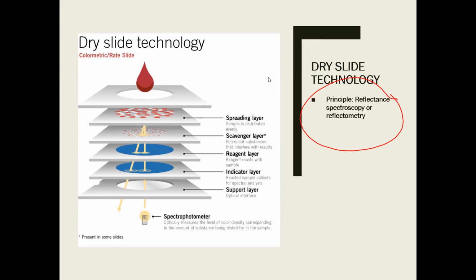Okay? Remember, guys, the light of the selected wavelength shines through the bottom of the cell.